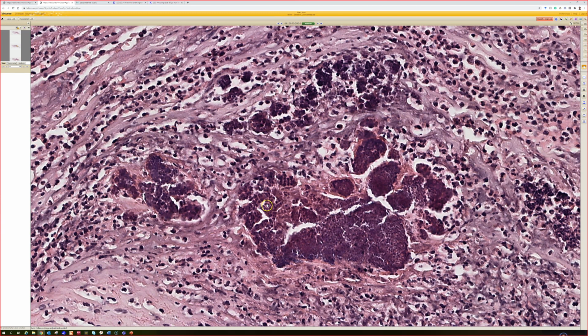These are actually little aggregates of 2 or 4. Sometimes they make little kind of square shaped clusters of cocci. And on this scan, it's really difficult to see, but in real life, usually when you look closely, you can see that rather than the long filamentous structures of Actinomyces, or the actual fungal hyphae of eumycotic mycetoma, in botryomycosis, you're getting that same kind of sulfur granule look, but the structures it's made of are cocci bacteria.